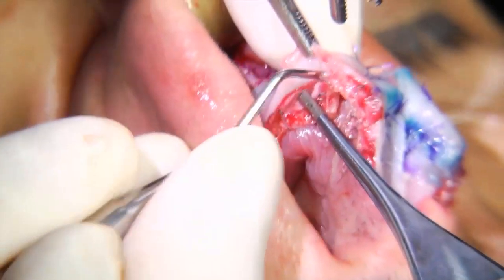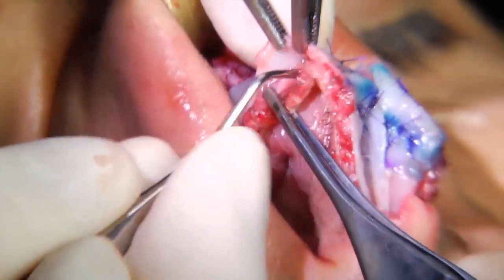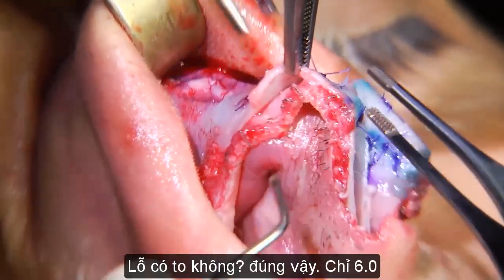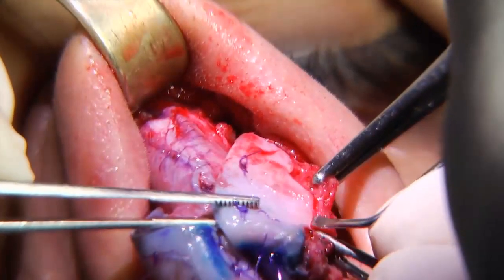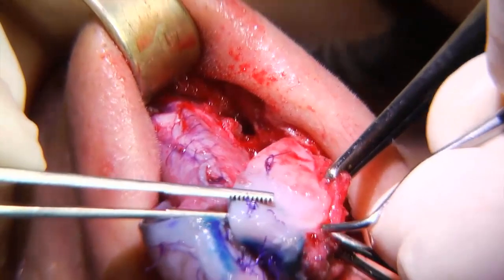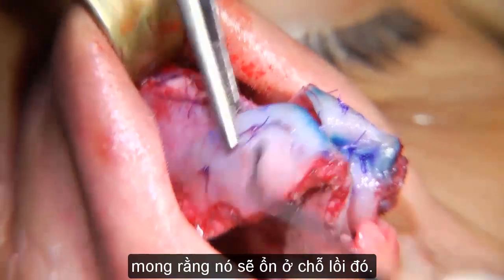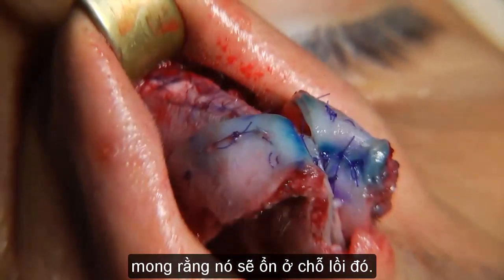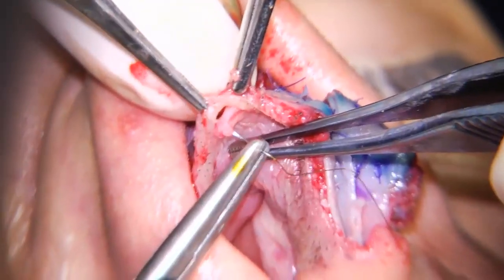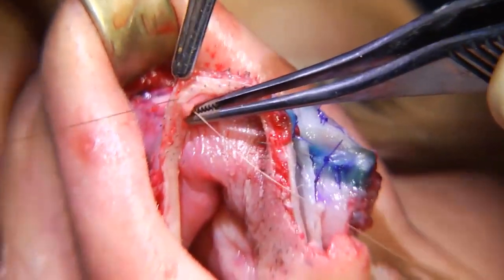6-0 Vicryl. Okay. Is it a big hole? Yes, 6-0. So why am I doing this? Because I think I will use the caudally extended lateral strut, hoping it's okay for the convexity. I need to close this thing. It's minimal, dai. Okay.